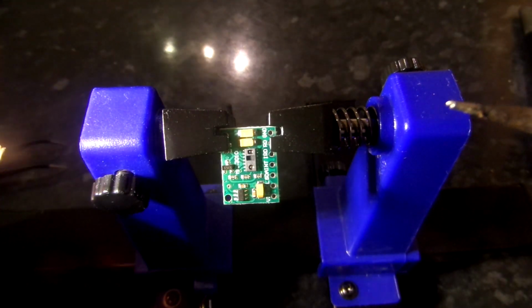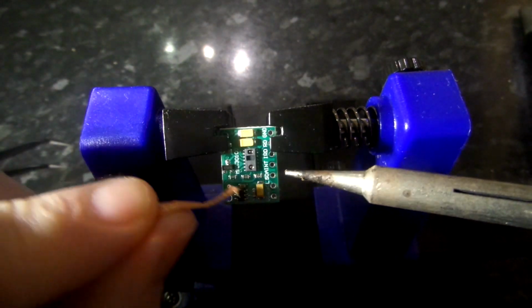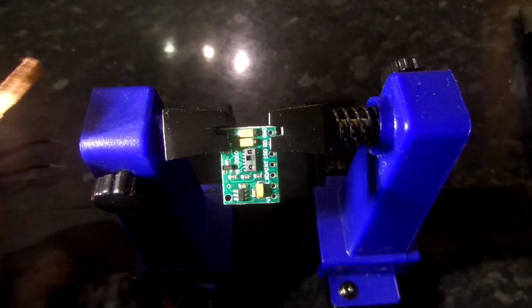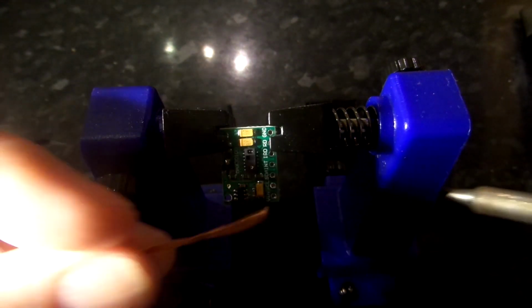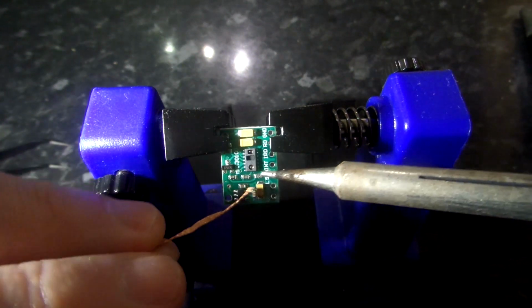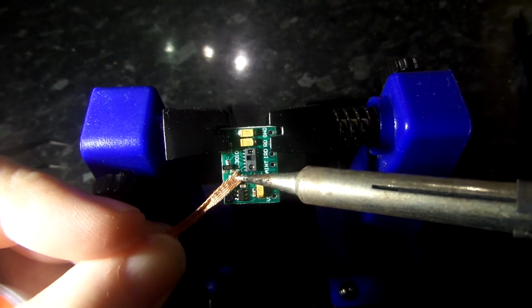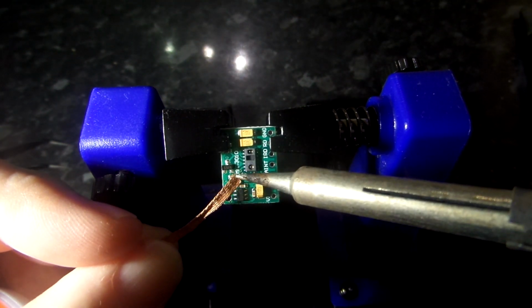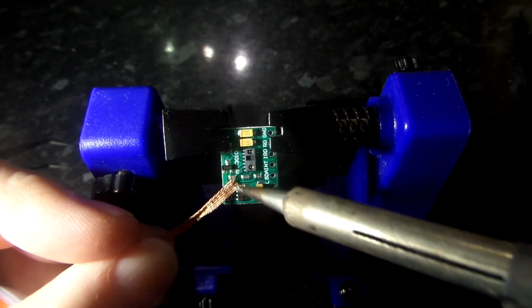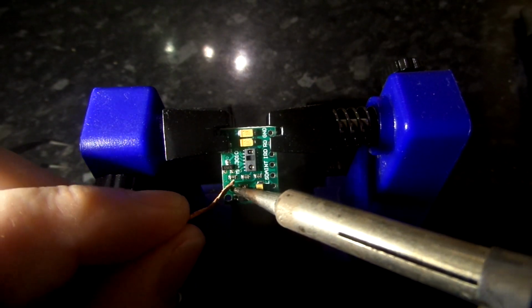I've got a camera, I've got a magnifying glass, and I'm trying to get my hands in and actually desolder these as best as I can. Let's just clean that tip a little bit. And okay, let's have a go with this one first. Get the wick to just drag up some solder. That'll be the plan. Yeah, I've definitely got a little bit up there.